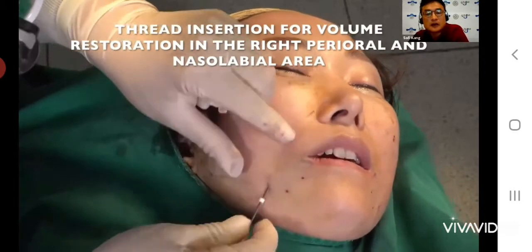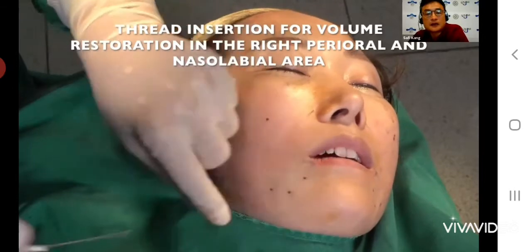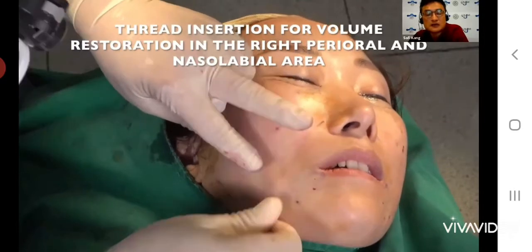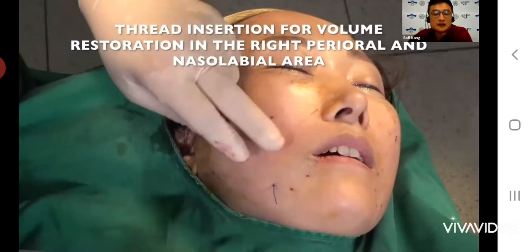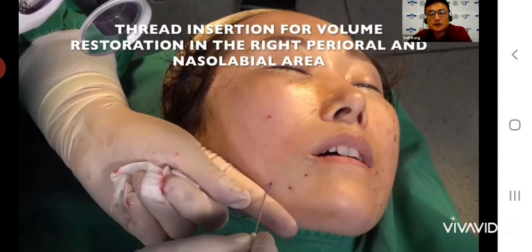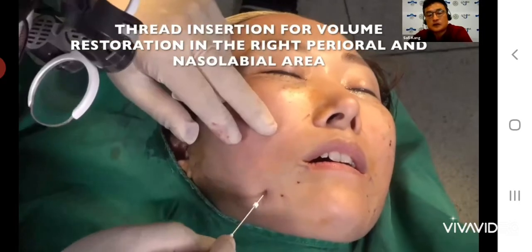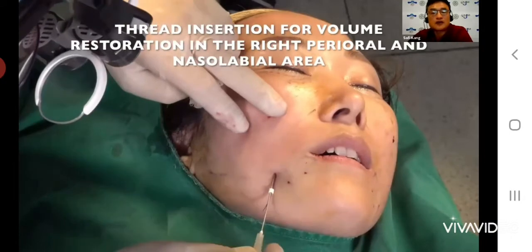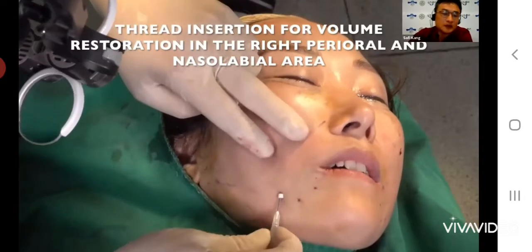This lateral fold actually has a much greater soft tissue volume defect in the deep part beneath the skin than the left side. In this case, you can check before surgery. Let the patient smile. You can see the difference in the extension and the figure of the smile. Before surgery she used the smiling action much more on the right side than the left side.